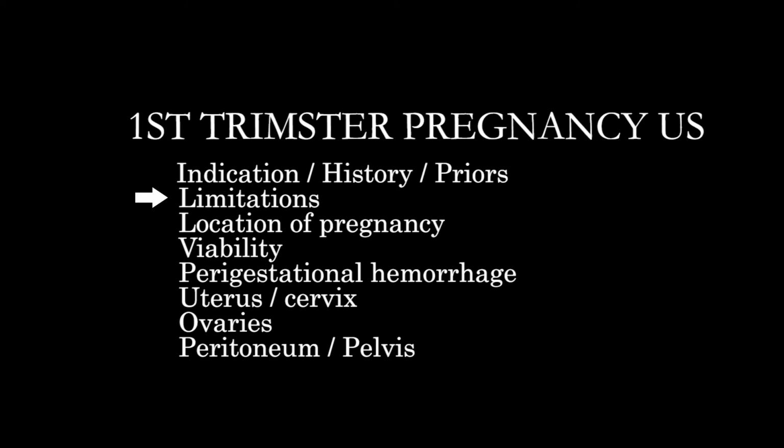But you're going to avoid using that anywhere near where there could be a normal pregnancy. Similarly, when we look at cardiac activity, we're going to be doing that on M mode, rather than using color or spectral Doppler. With all ultrasounding, we'll scan real time as necessary and figure out what's going on with the patient, with correlation to the patient's symptoms.